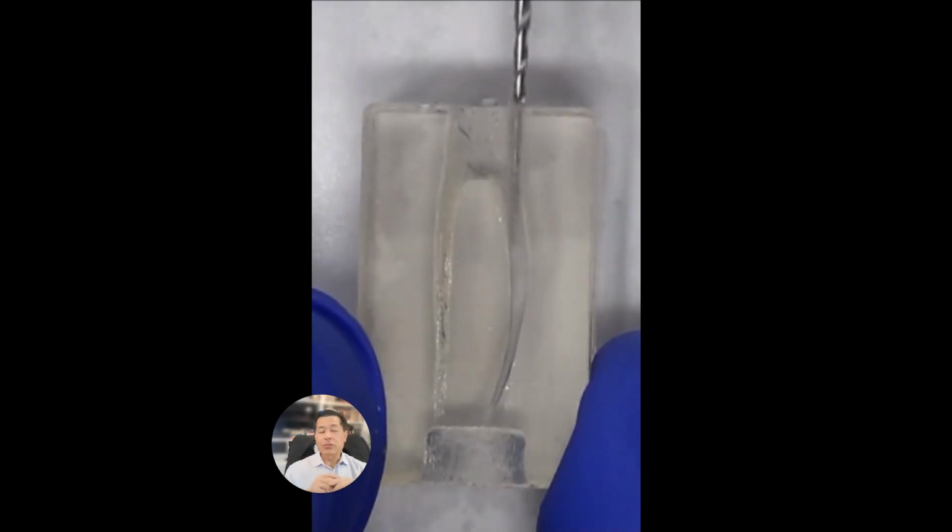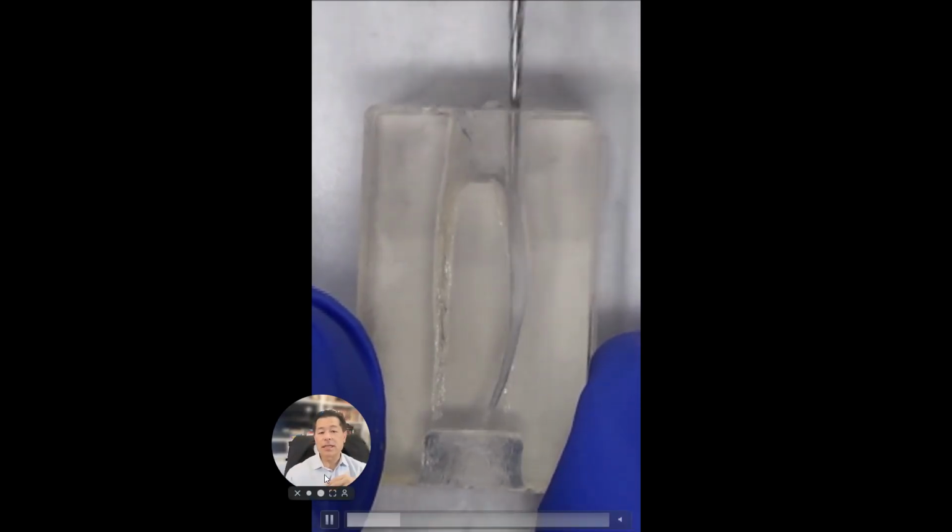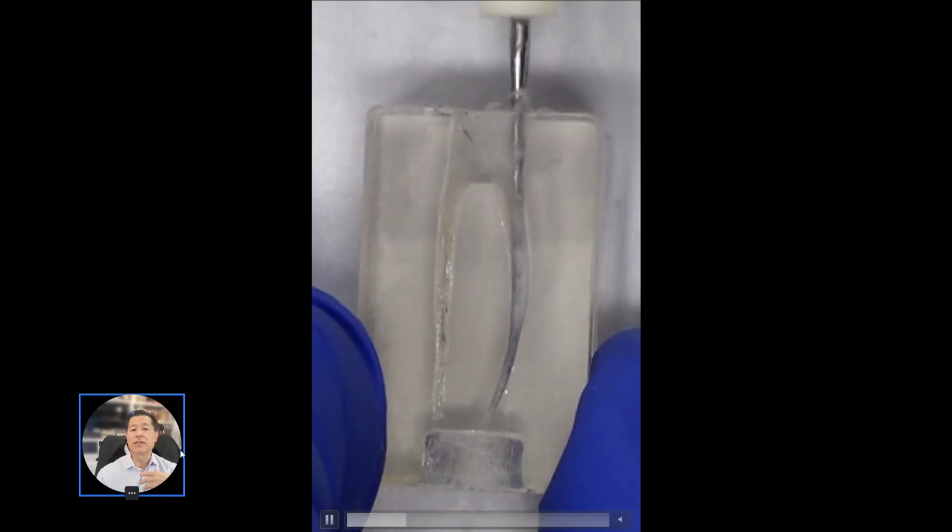So I've shown you in past programs that studies show that when we take a file and we go up and down the canal, we don't always clean the canal out well because our files don't necessarily touch all the canal walls. And what this video is showing is, look at all the mud. When I look at the file in there, you can't see it because it's in a cloud. What's it in a cloud of? Well, in this case, it's a cloud of acrylic because we're scraping the canal walls.